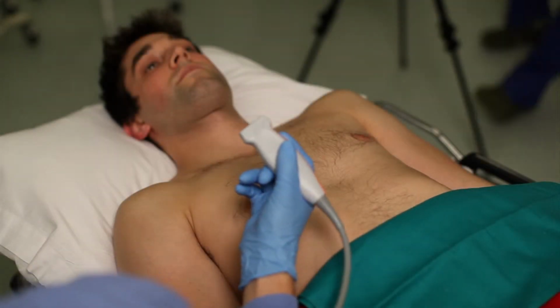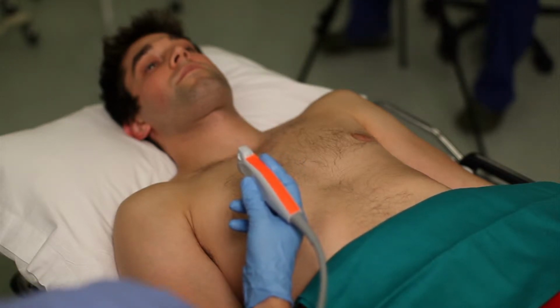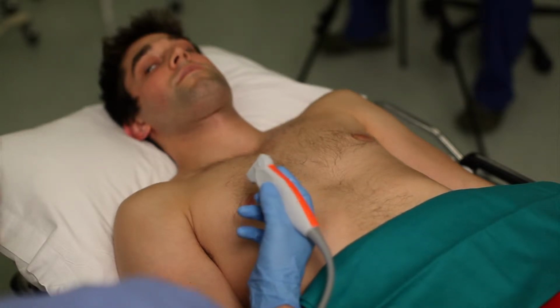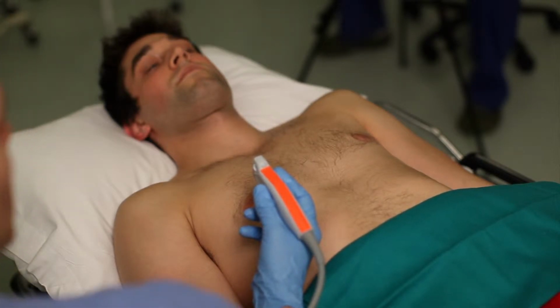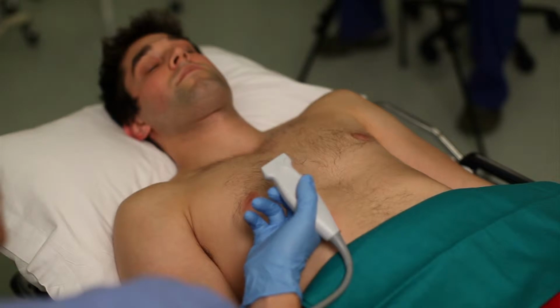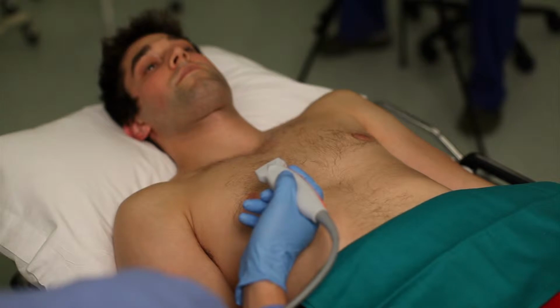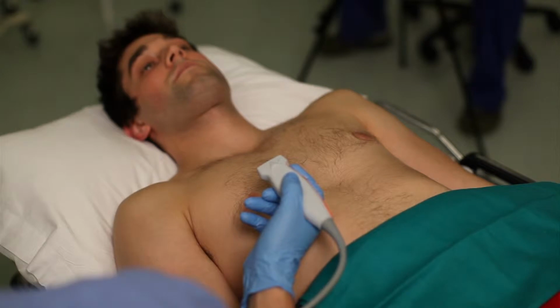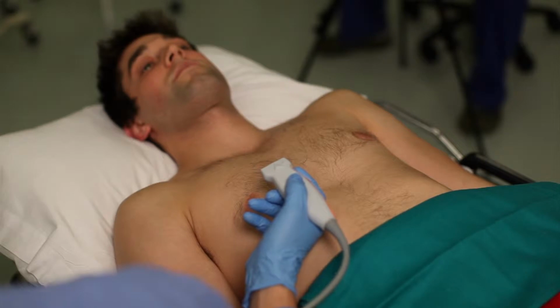We're ready to discuss lung ultrasound with a different probe this time. Notice I have the vascular access probe with a maximal depth of 6 centimeters. We've also marked this probe with an orange tape to indicate where the indicator notch is. The reason we're doing this is because when you're doing vascular access, for example, using ultrasound for an internal jugular access, you already have this probe, and so you may wish to rapidly assess the lung ultrasound prior to doing an invasive procedure, and you can also do it immediately after the procedure to look for possible complications.